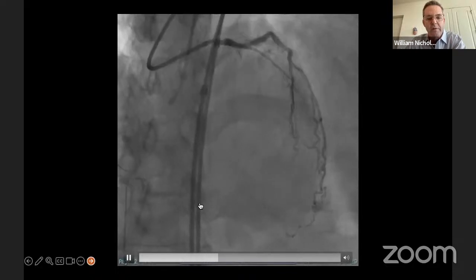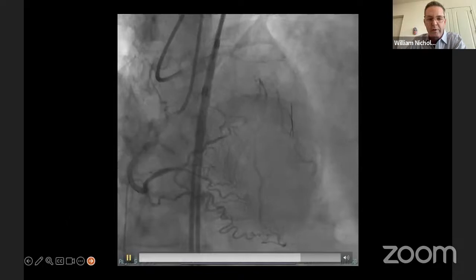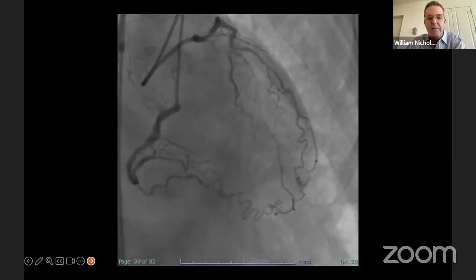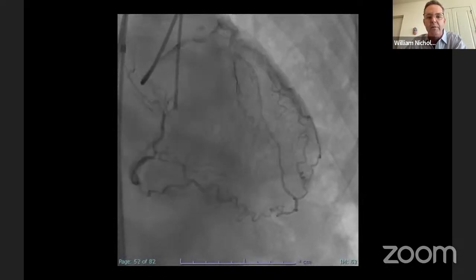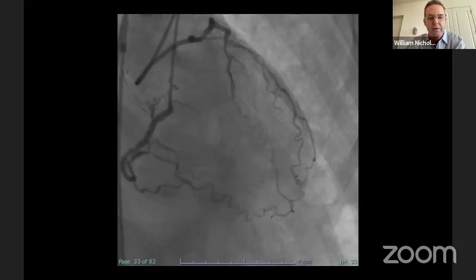But if you look here, I'm going to pause this so you can see. If you forget about the septals and you stay in this branch all the way out here, this does connect upstream. So we took a SUOH 3 there, and we were able to navigate our way out to that segment. This is just another example showing you what the LAD diagonal is going to look like with dual injections. If you wait till the very end of the contrast, you'll see the complex anatomy that we're in for.